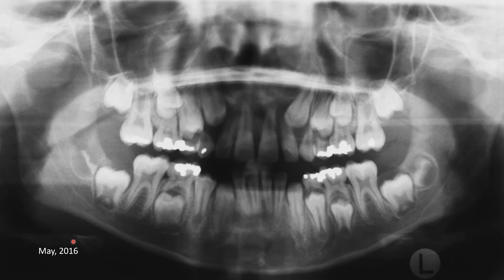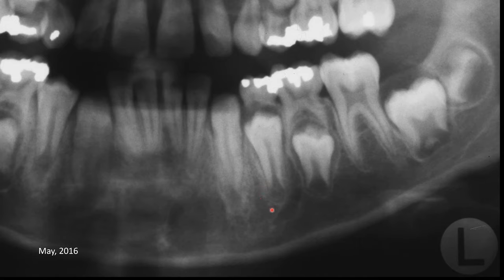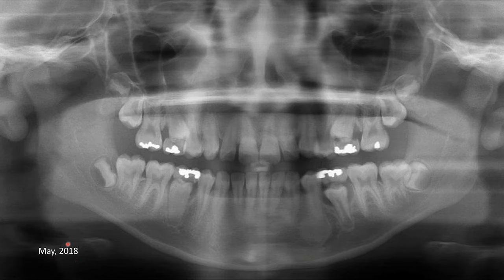This is a radiograph from May 2016. Again, let's zoom to the area of the premolar. Interestingly, at this time we do not see that radiopacity. The trabecular bone around this incompletely formed root of the premolar seems normal.